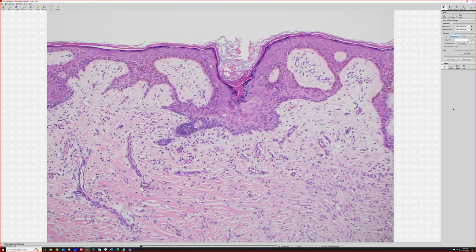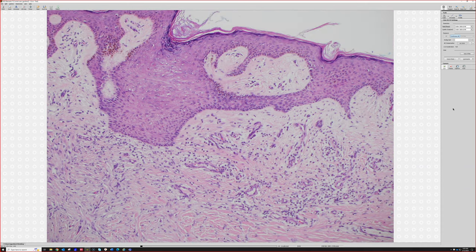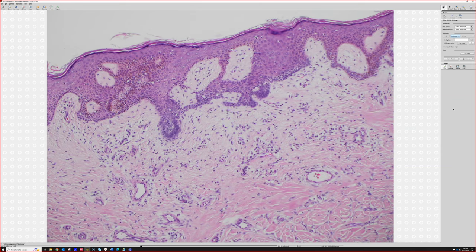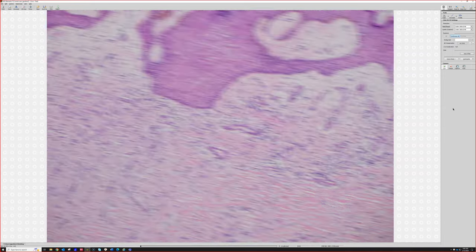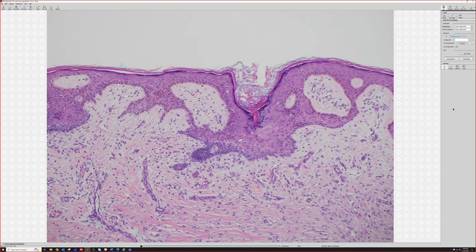We also begin to see some basaloid little buds coming off the epidermis with a spindly and myxoid sort of stroma around them. This is not basal cell carcinoma — this is benign hair follicle induction. These are little baby immature hair follicle roots that are starting to grow. For some reason dermatofibroma often makes the epidermis over it grow and change in different ways, with epidermal hyperplasia, pigment, and variable amounts of hair follicle root development that can mimic basal cells. So on a test, if you think it looks like a basal cell and there's a DF under it, the answer is no — it's just a dermatofibroma with benign follicular induction.